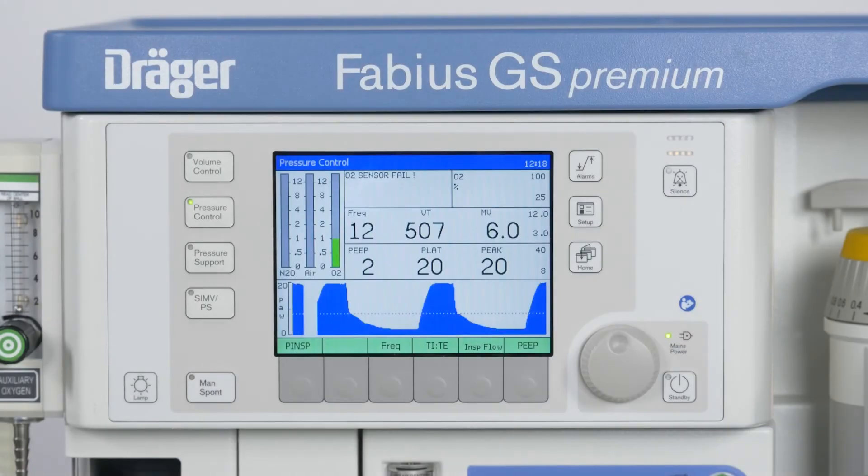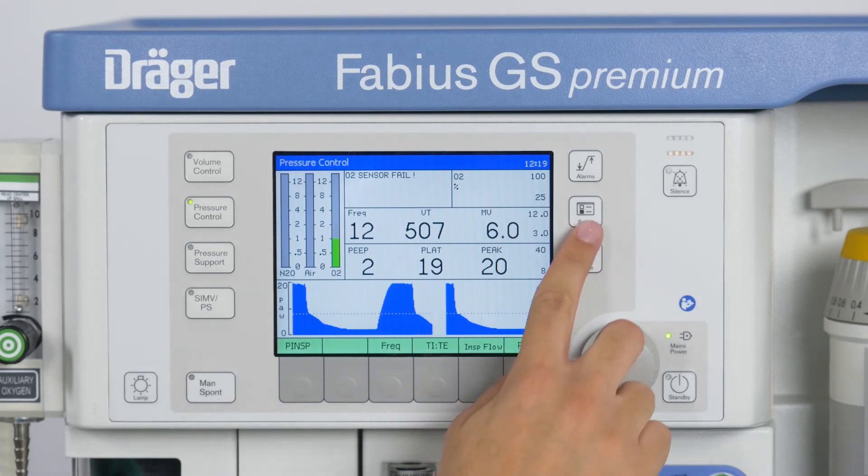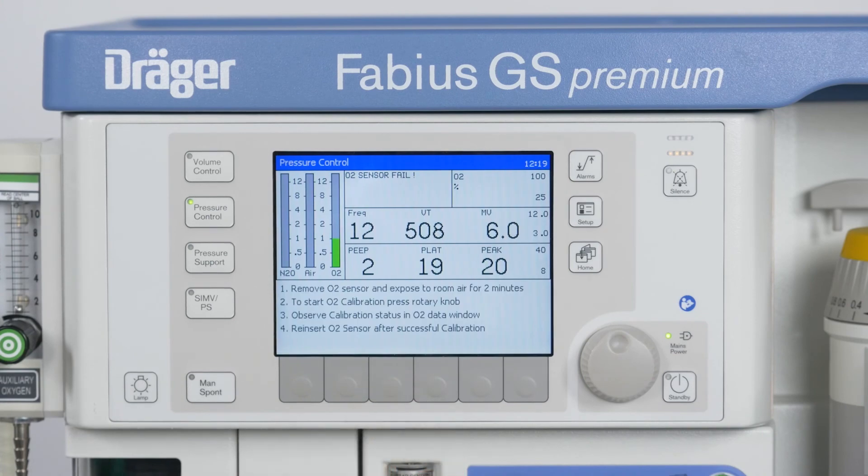If the Fabius GS Premium indicates that the oxygen sensor calibration is due, you can perform this at any time during operation by pressing Setup and following the instructions on the screen.